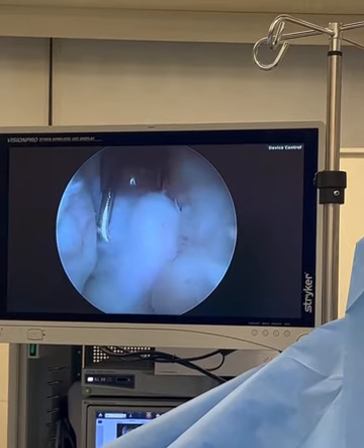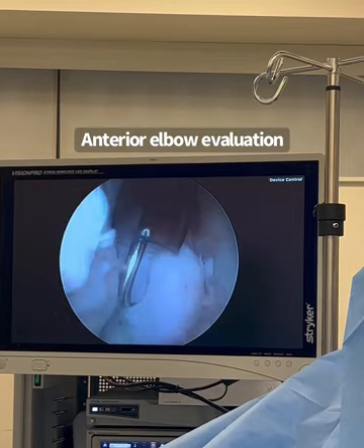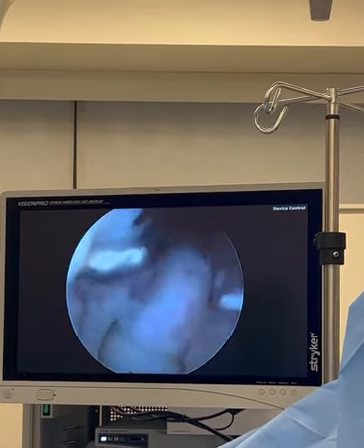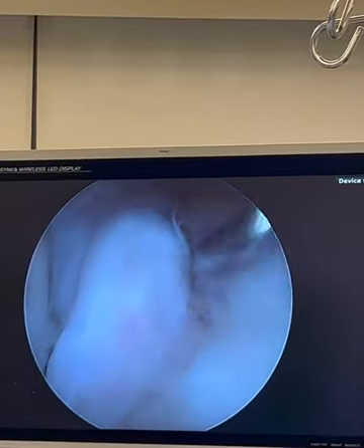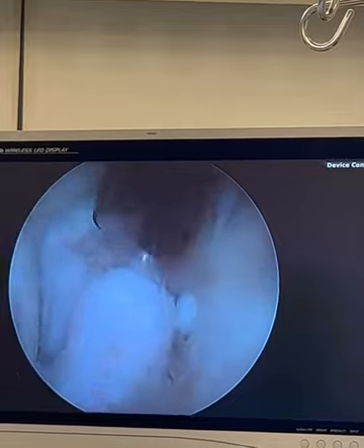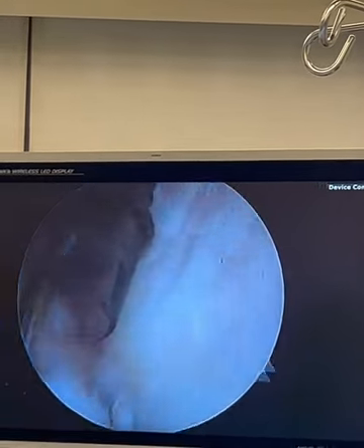This partially loose body here — this piece of bone that's moving around — doesn't belong here. It was probably a loose body at some point that got stuck. This will all be cleaned up. There are multiple little loose bodies; I'll flush this out, chip this away, and remove it so that I can recontour this patient's joint.